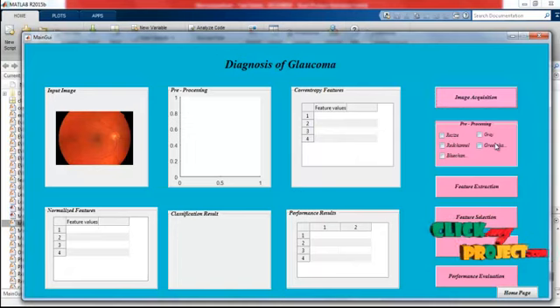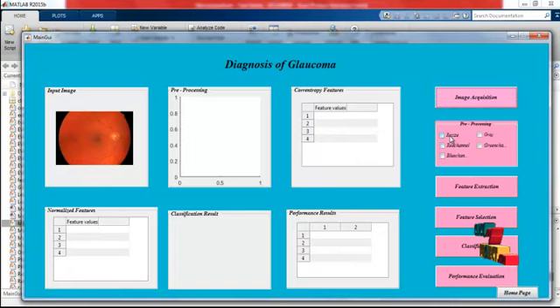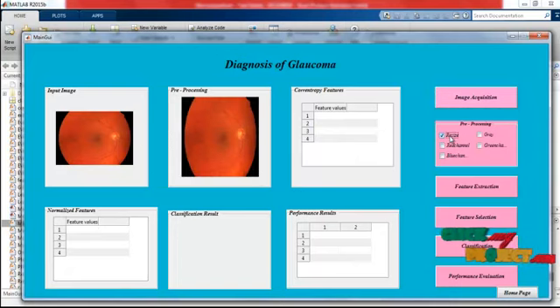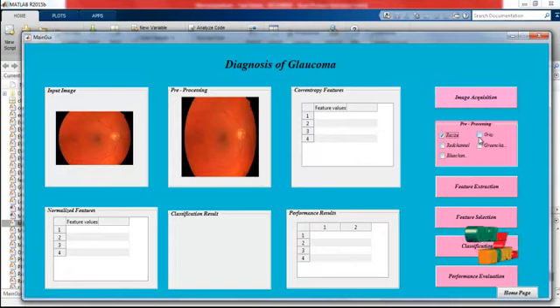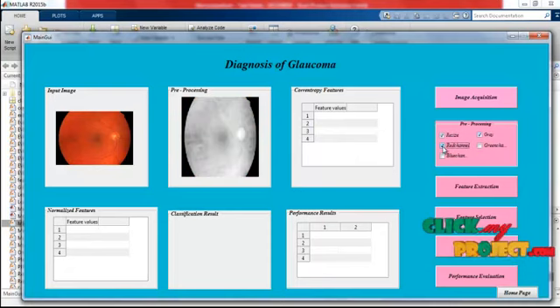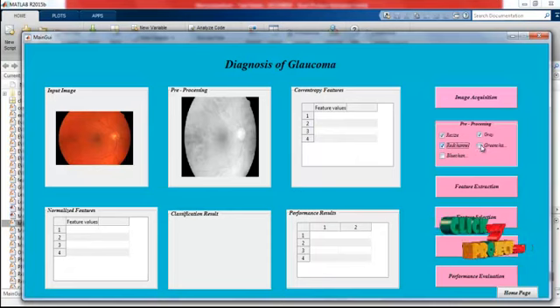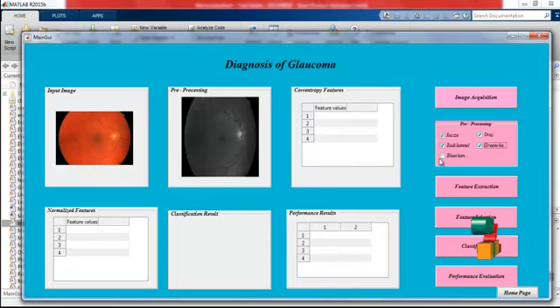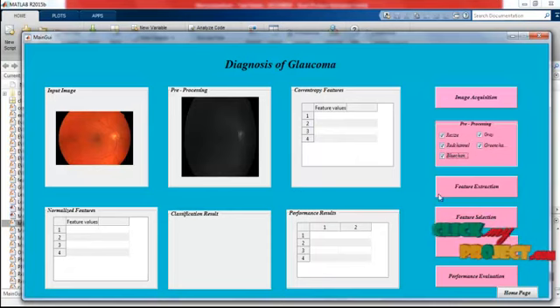Next, the pre-processing stage is shown. The operations available are: resize, grey conversion, red channel separation, green channel separation, and blue channel separation. Clicking the resize button shows the resized image. Then grey conversion is performed, followed by red channel, green channel, and blue channel separations of the image.